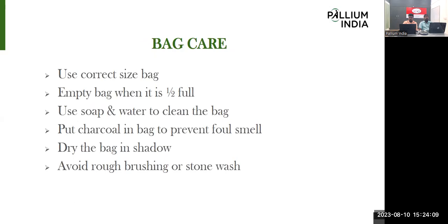As I already told, if the patient is using the two-piece colostomy bag, they can alternatively change the bag while keeping the faceplate on the same area. They can change the bag independently. They can wash it, clean it, and reuse the bag until it gets any hole or tear. At that time, use the correct size of bag only.